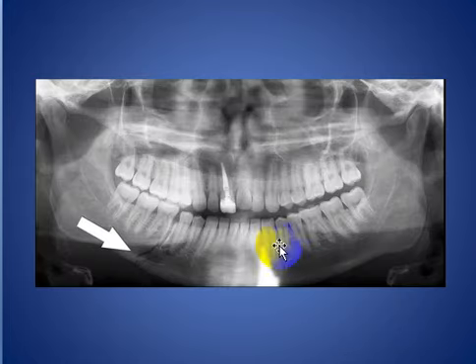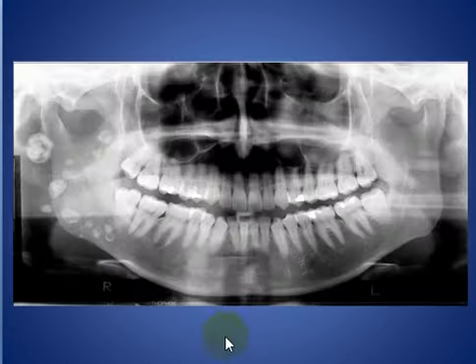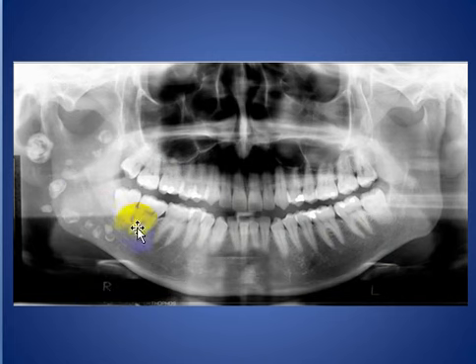Here a patient with a fracture with minimal displacement of the right side of the mandible. As we see here, this is the tooth filling, root canal treatment. And here we see multiple phleboliths overlying the mandible due to hemangioma.